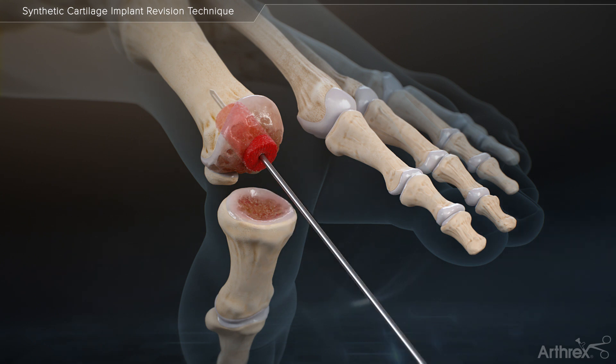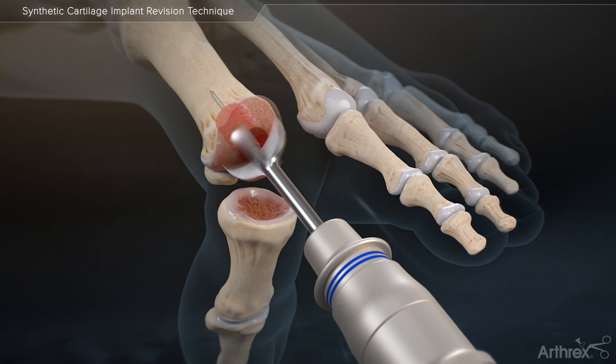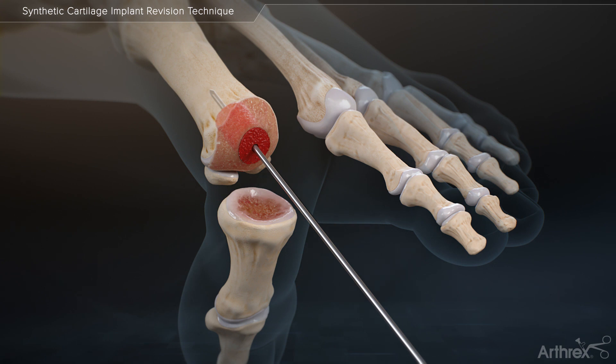Note that the bone graft may be left a few millimeters proud. Place the metatarsal reamer over the guide wire to simultaneously prepare the metatarsal head for fusion and contour the bone dowel until it is flush with the surrounding bone. It is important to remove all the original native cartilage from the metatarsal head as standard when preparing a joint for fusion.